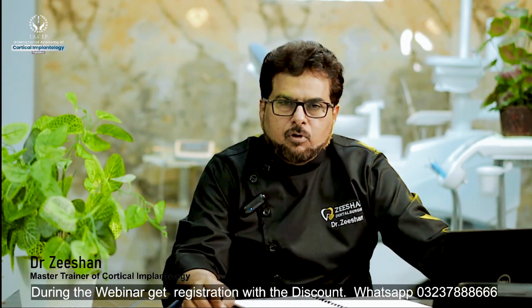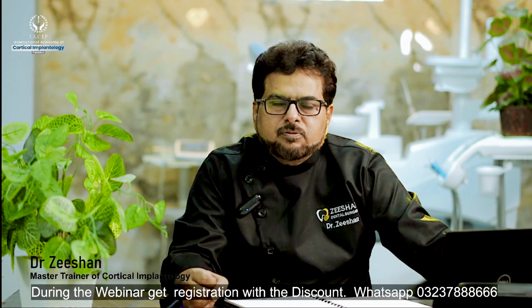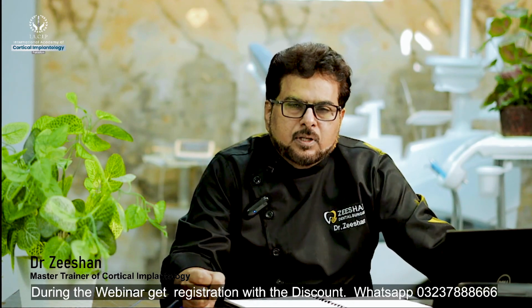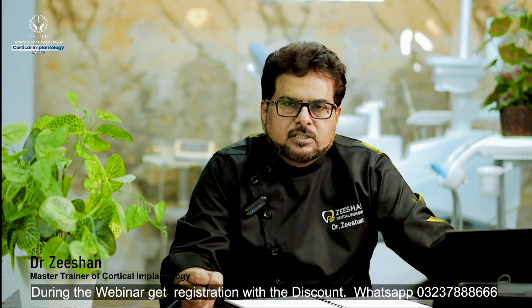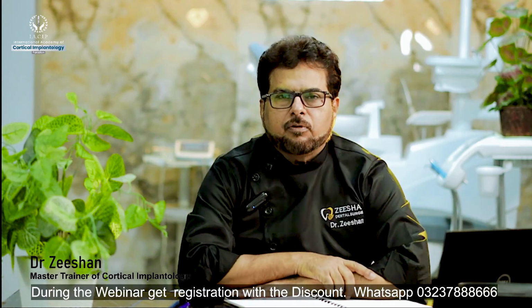Since cortical walls around the extraction socket are very hard, they are also a good site for immediate placement of implants. So immediate placement and then immediate loading is possible with basal implants and compressive implants. These are the two types of implants we are discussing today for immediate loading.